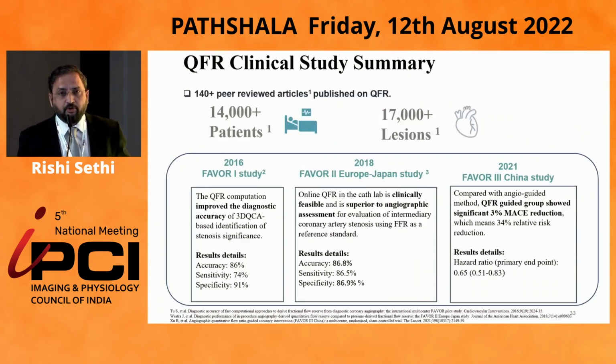QFR values have been shown in the FAVOR 1 study in 2016 and the FAVOR 2 study in 2018 to correlate with FFR values.